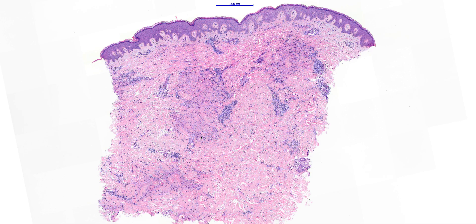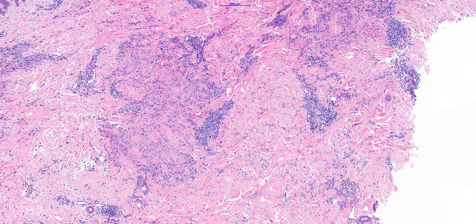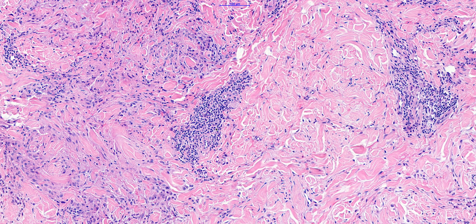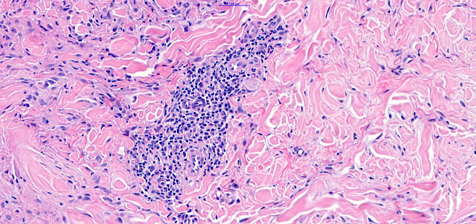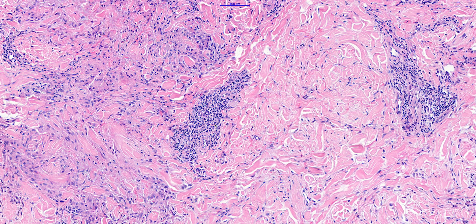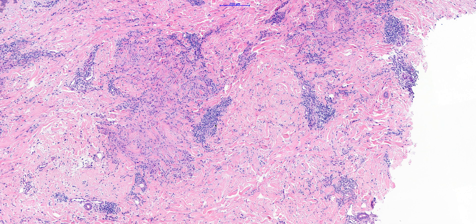As well as the areas of necrobiotic granulomatous inflammation, you very often also get a perivascular lymphocytic inflammatory infiltrate. Sometimes you can see some eosinophils mixed in there as well — quite hard to see many in this example, but it's not infrequent to see eosinophils mixed in with granuloma annulari.